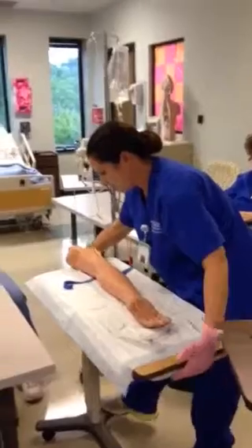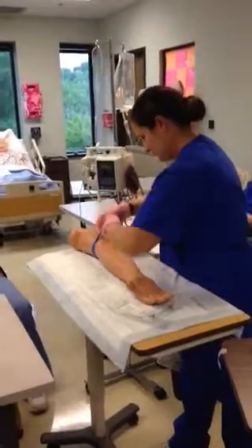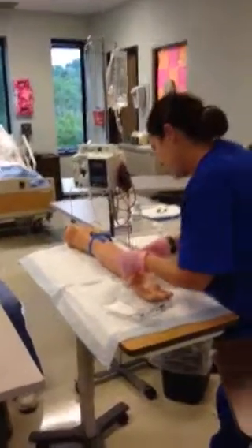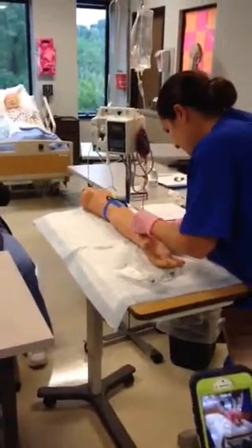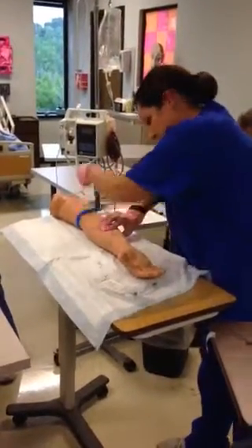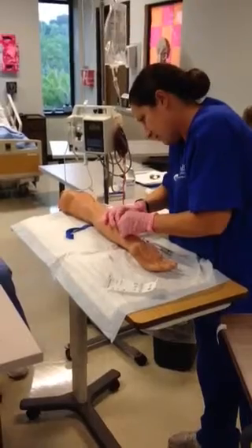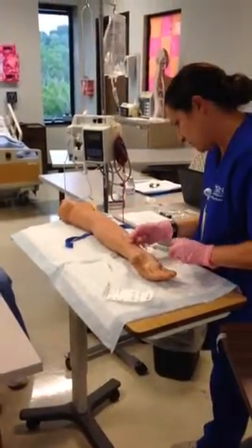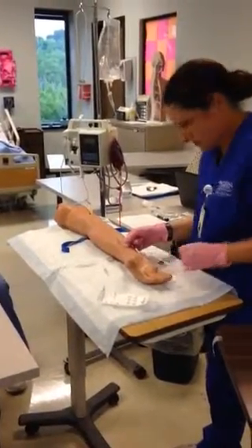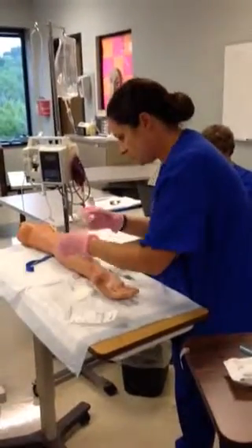Pearl, I'm ready. Raise you up just a little bit. There we go. Here's that tight band again. Tight band. And a big pinch. All right. There we go. See if this is working all right. Great. All right. Hold real still for me.